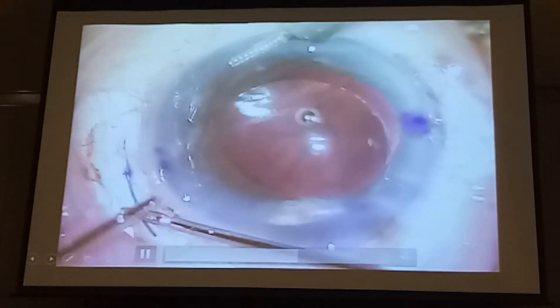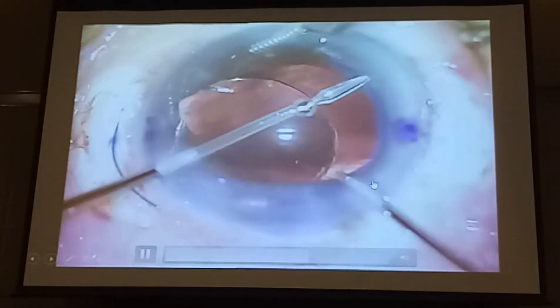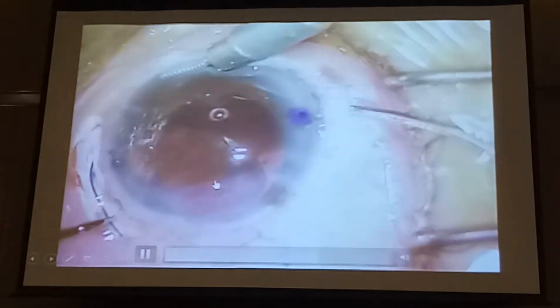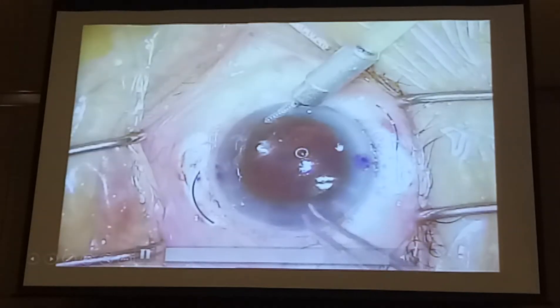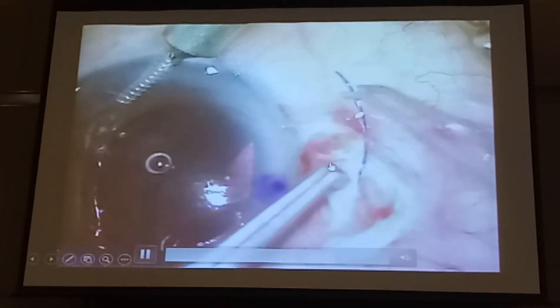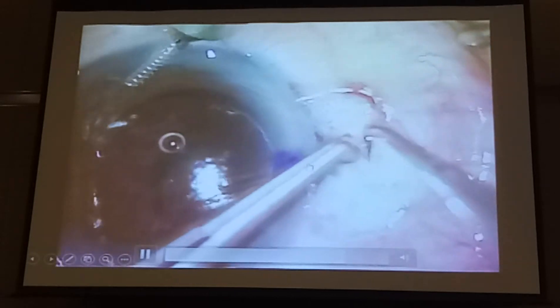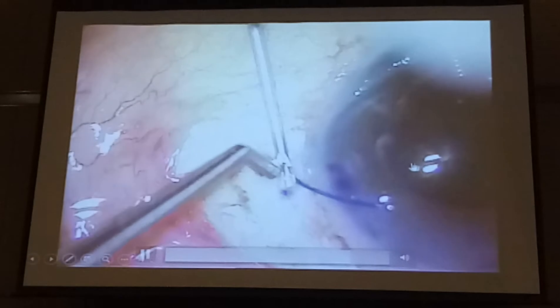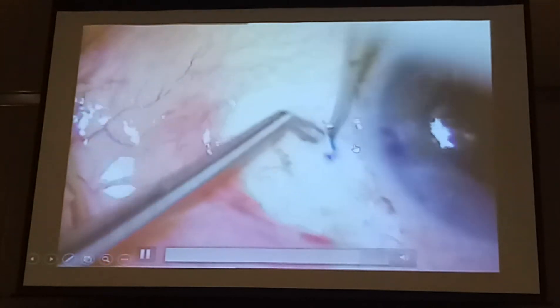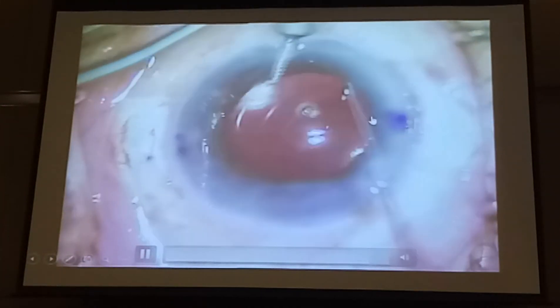Cut this. Now when you have infusion coming, be very careful — this half can actually drop. So you cradle it, move it under the other half to form like a plate support, and then we remove this. I do a peripheral vitrectomy first, so that when my lens goes in I don't have a problem. I do a peripheral iridectomy and self-deepening of the anterior chamber — this is a 23-gauge vitrectomy. This is a CT Lucia, which I love, but unfortunately we're going to stop using this soon.